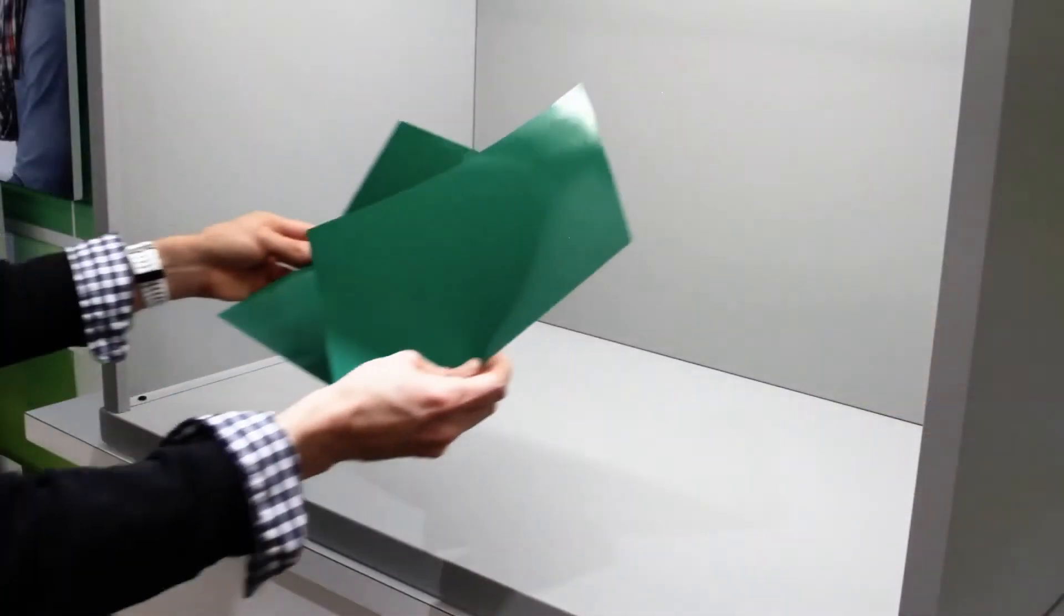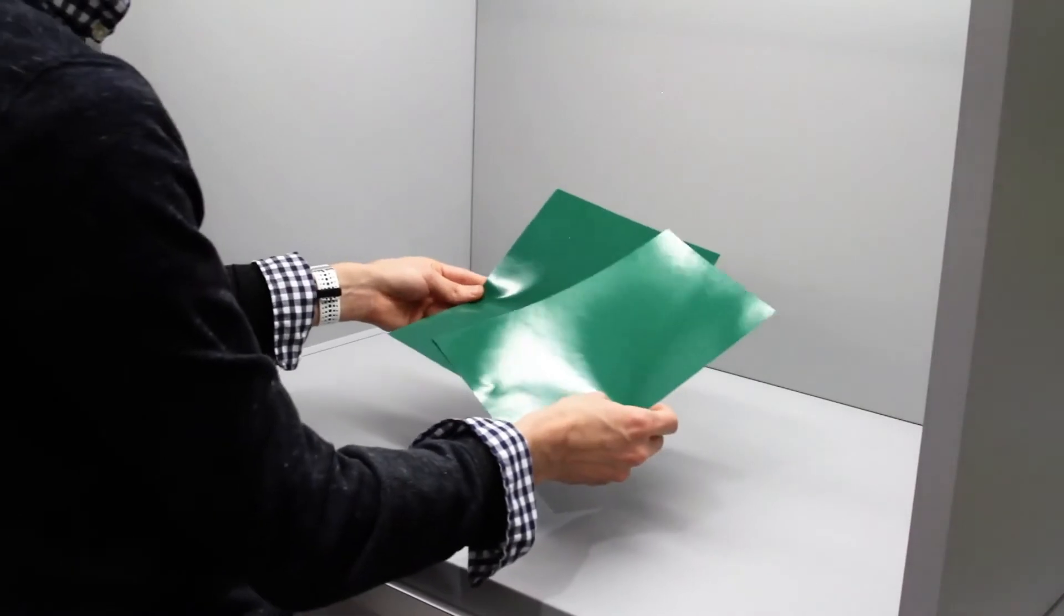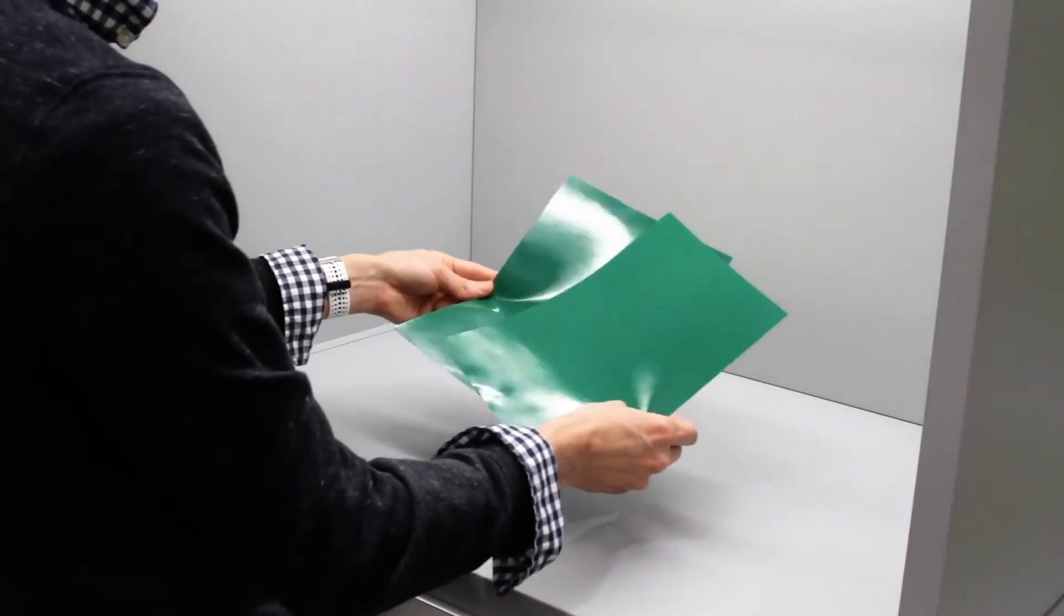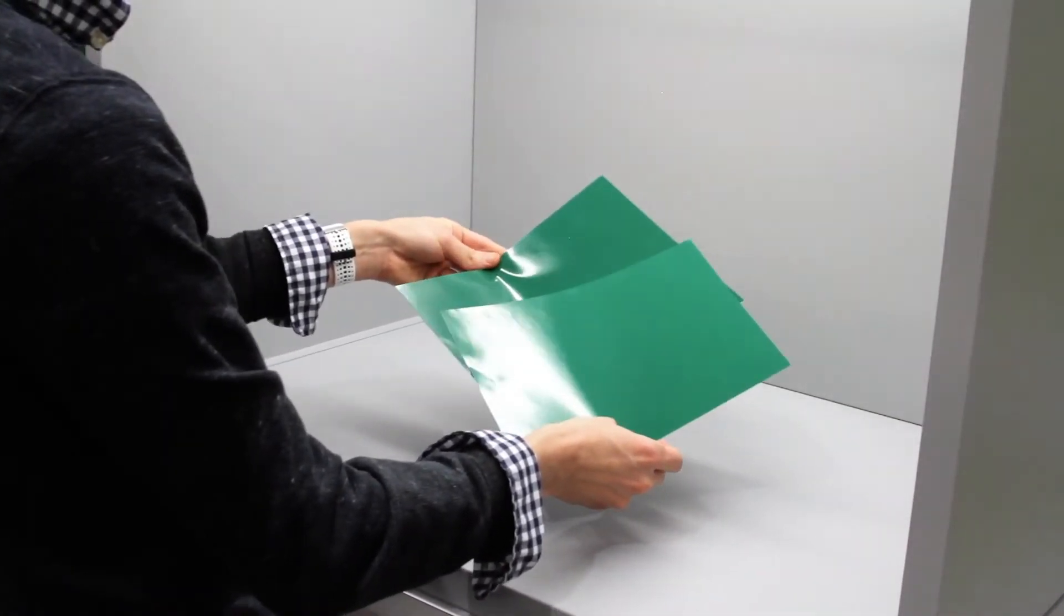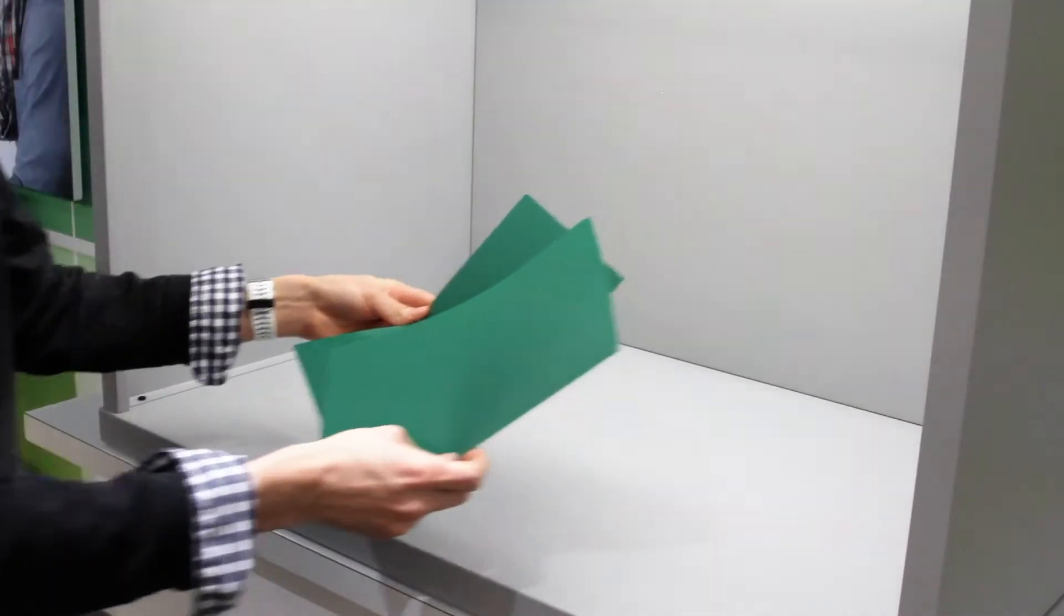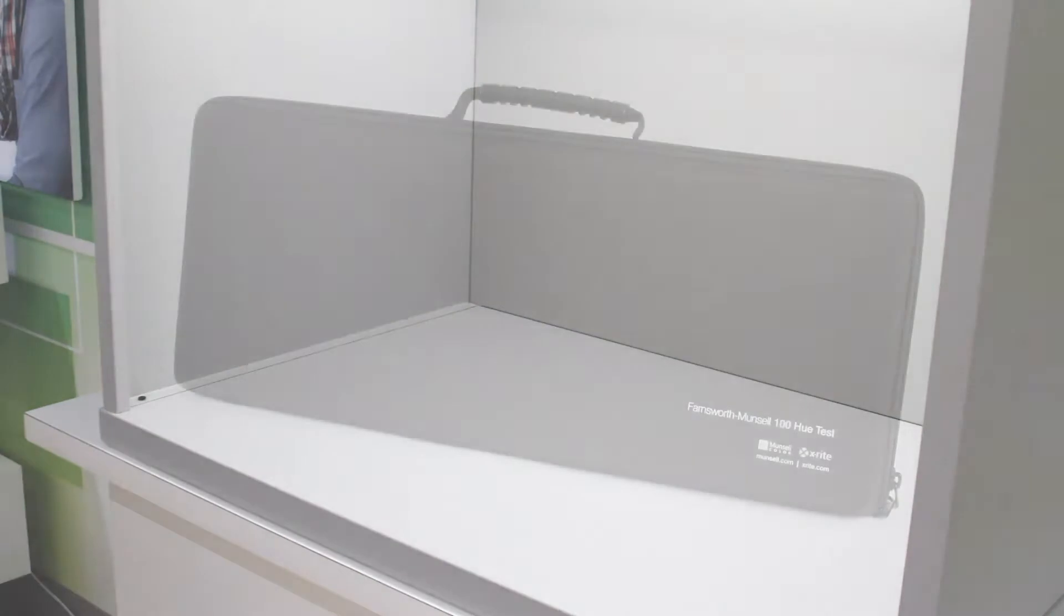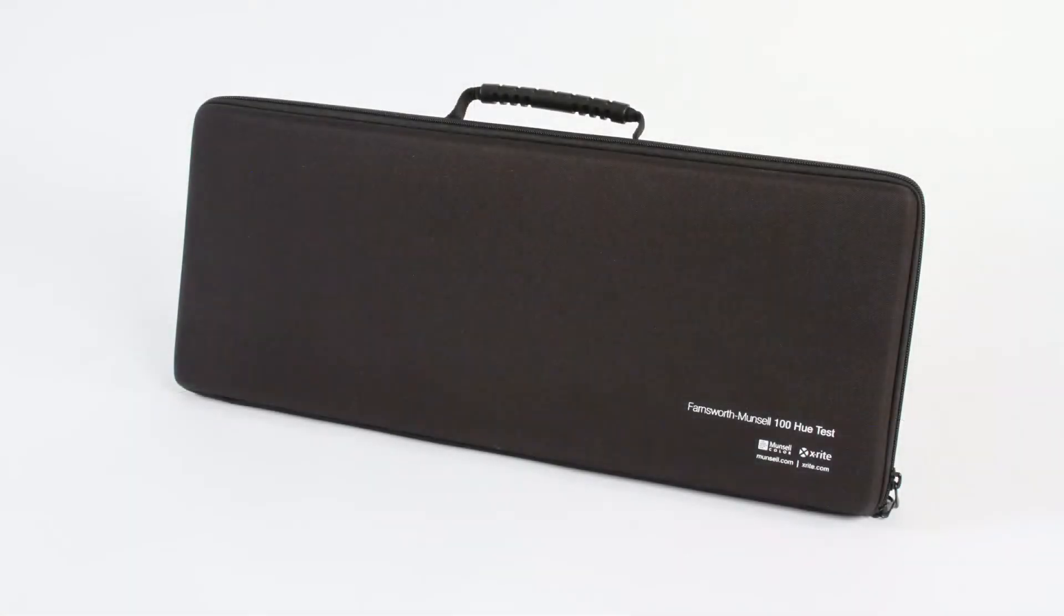Understanding this allows you to ensure that they can accurately evaluate and communicate color decisions with others. Let's take a closer look at how the test works and how to administer it.